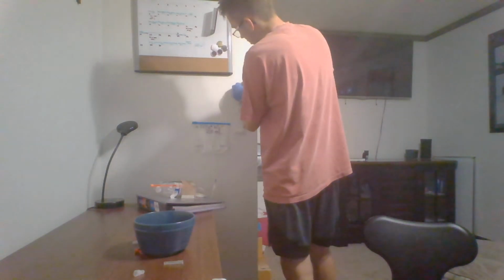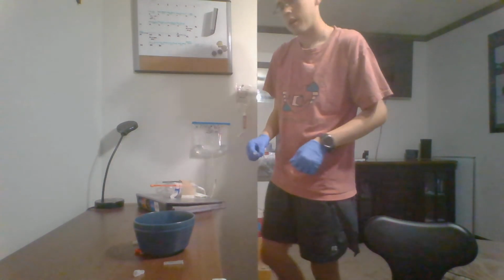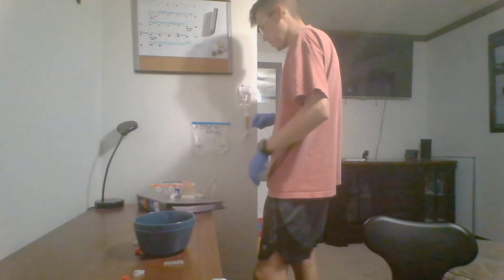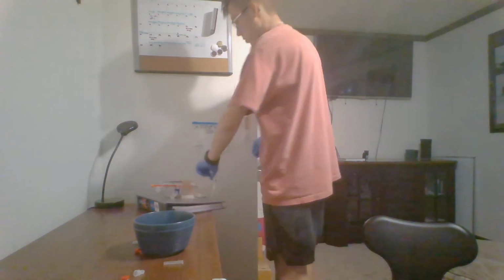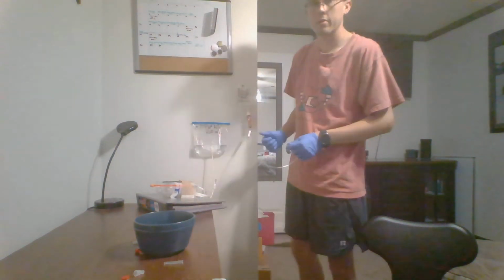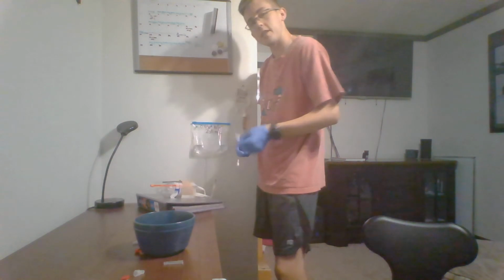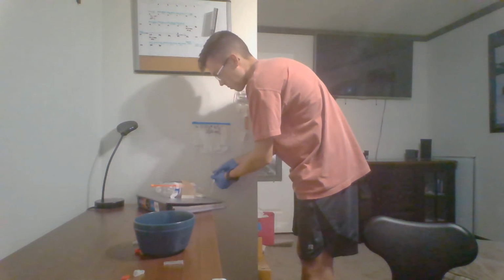And then when I go to hang this, I'm going to want to make sure that my piggyback solution is higher than my actual solution. I will then go and recheck my medications one more time, check to make sure that I have everything right. Then after I am done here, I will stop the flow rate on my primary line. The flow rate on my secondary line should already be closed. I will then take an alcohol prep pad and I will clean off my Y port.